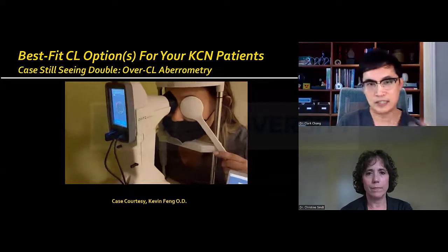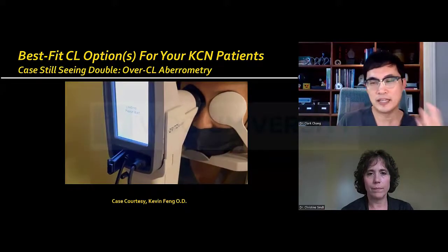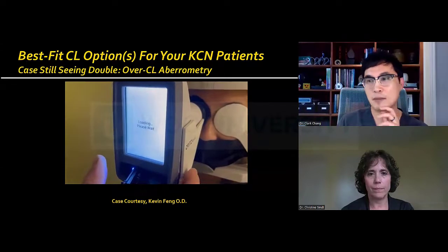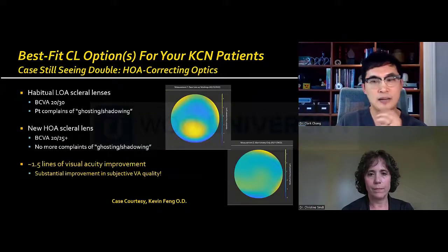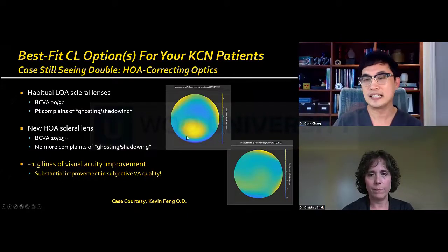And this is a demonstration, this is not a patient. So we use the instrument with the lens on, cover one eye to reduce the possibility of accommodation induced myopia. And then we use that to create a lens with the engineers at the lab. You could see that the amount of coma present in the right eye through the standard bitoric haptic scleral lens, we were able to redistribute with the first HOA lens to be much more even.